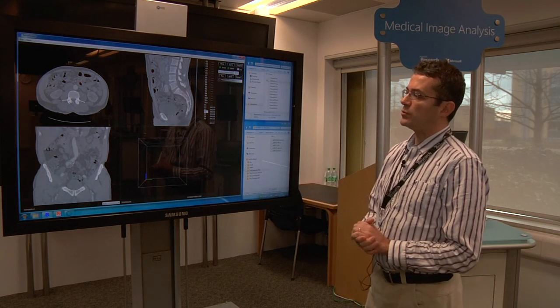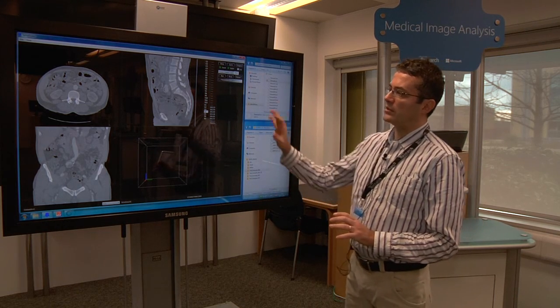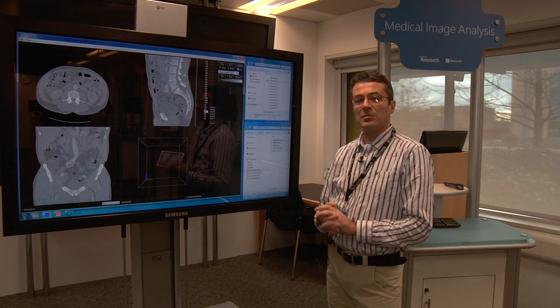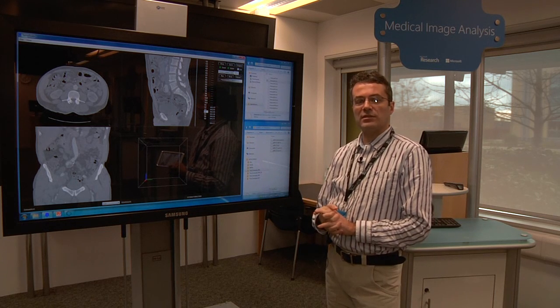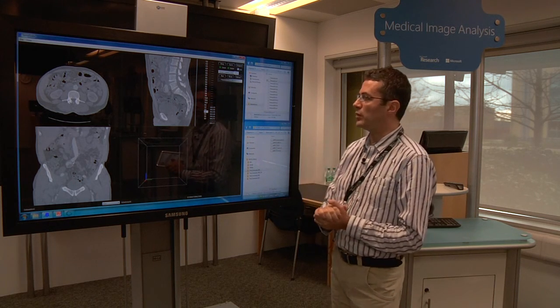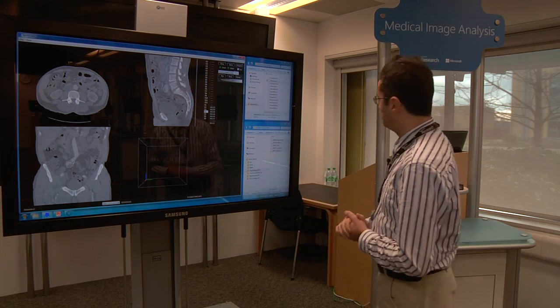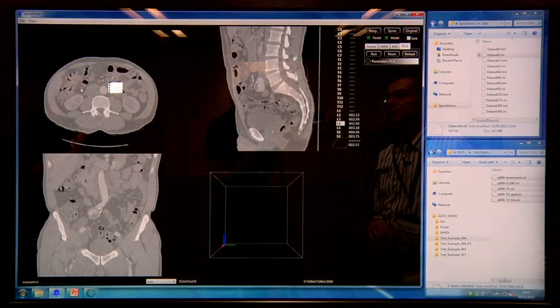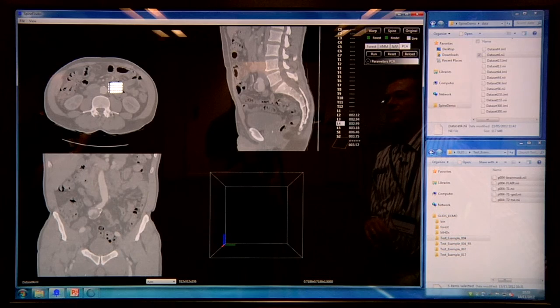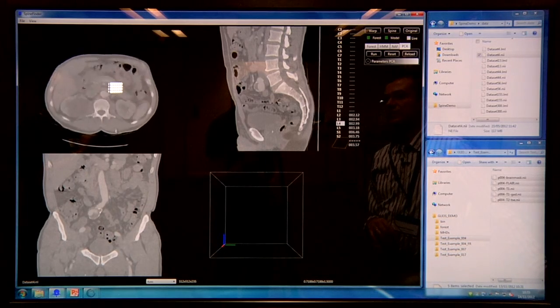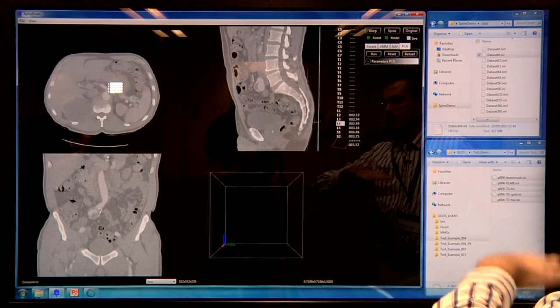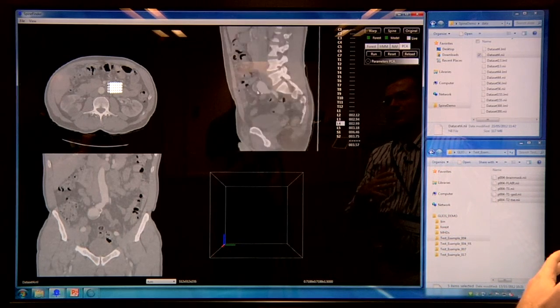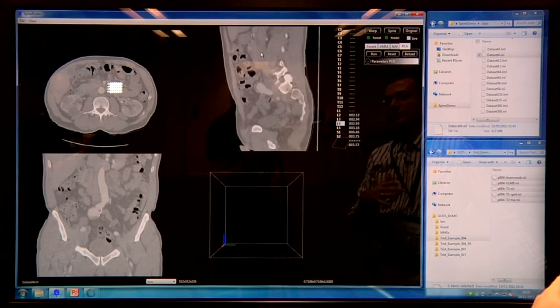So we have two demos: one to do with the analysis of CT scans and the other one to do with the analysis of magnetic resonance scans of a patient's brain. In the first demo, we have already loaded a patient image. You can see the different horizontal views and the different side views of the patient.